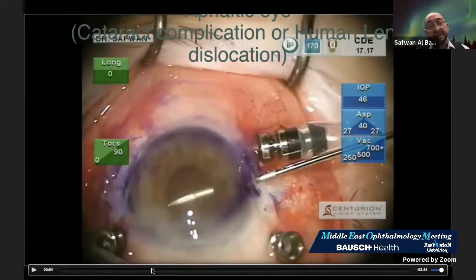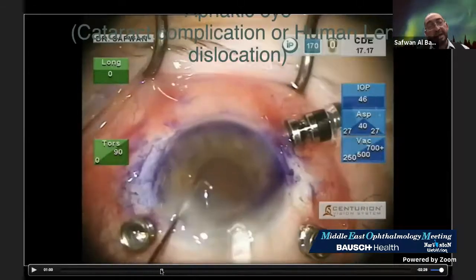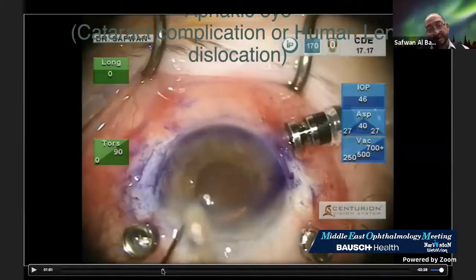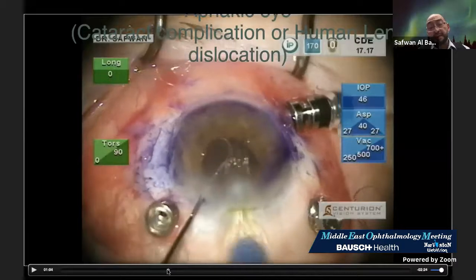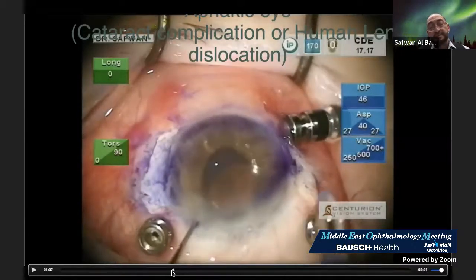See, this is the gauge 23, either serrated or tying forceps, and then implant the lens. Very clear. I'm using the usual injector, the injector for the IOL, or any injector that is suitable for this lens. 2.2, lens in, vertical on the iris, then rotating the lens.